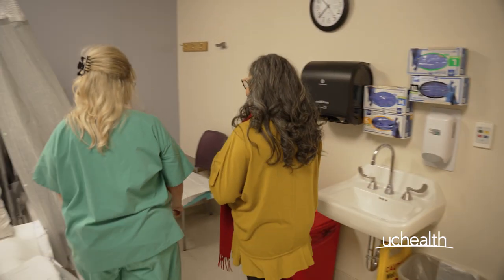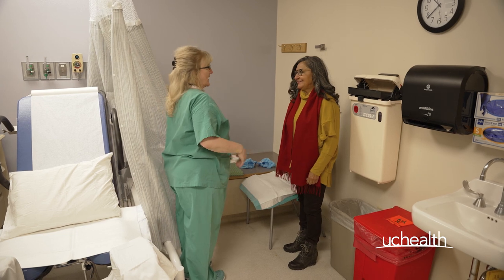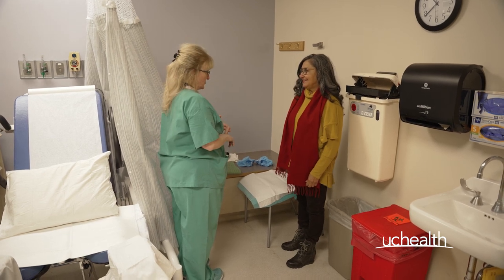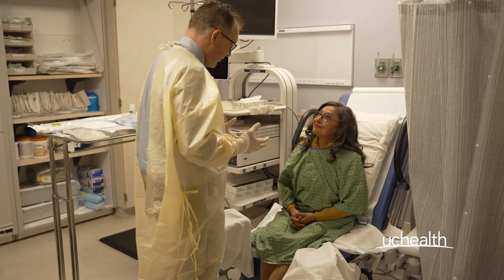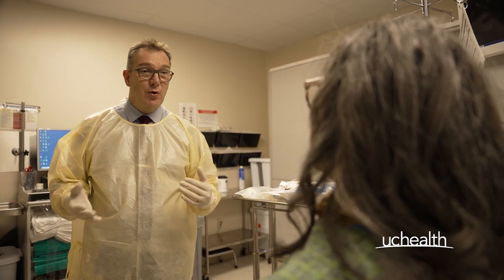Once all of those things are done, you'll be taken round to our procedure area. You'll be asked to put a gown on and your whole genital area will be prepared and cleaned for the procedure. The provider will come in, they'll talk you through it — it's quick — and then they'll explain to you what you need to do afterwards.